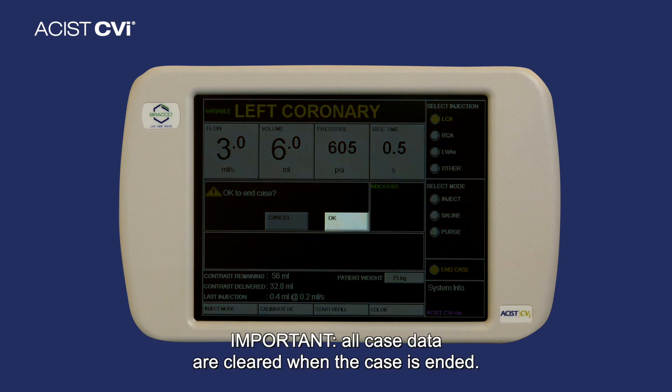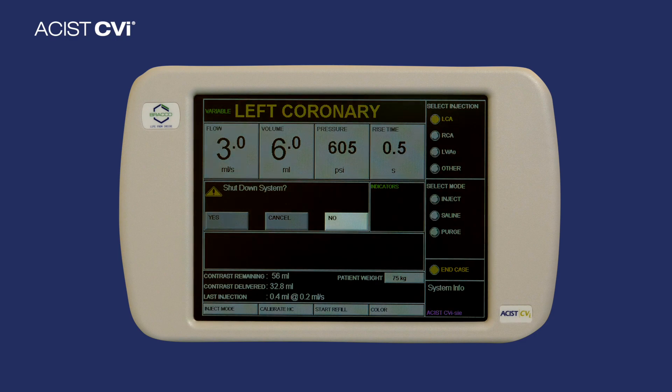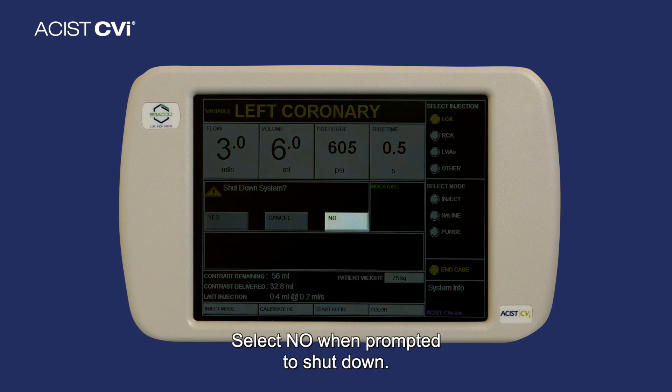All case data is cleared when the case is ended. Step three: select No when prompted to shut down.